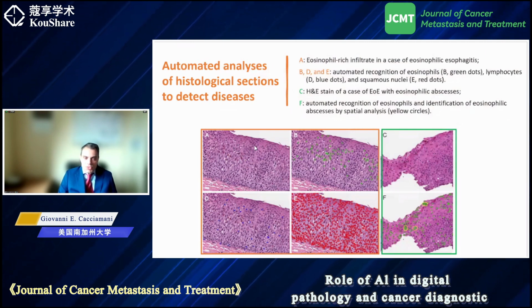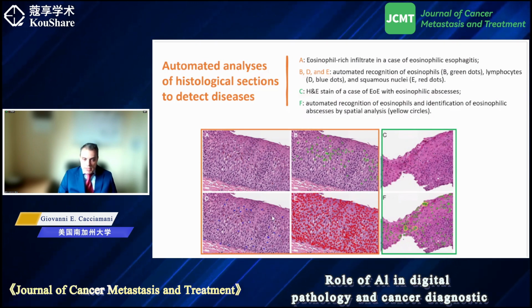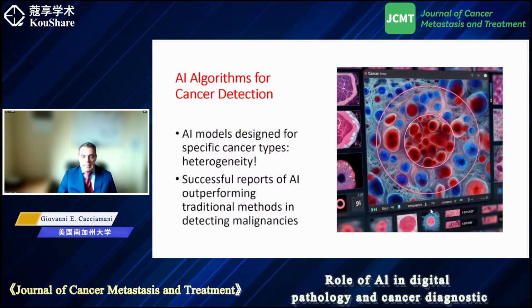So once again, starting from a squamous cell mucosa here in the esophagus, we can recognize here, depicted in green, eosinophils that are characteristic of some phases of acute esophagitis, but also of chronic eosinophilic esophagitis. By contrast, other cells, like the squamous cells of the epithelium, can be distinguished and numbered. And when we put together the single cell with the pattern of aggregation of cells, we can even recognize small abscesses through the layers of the mucosa. So really interesting, at least on the basis of the analysis.